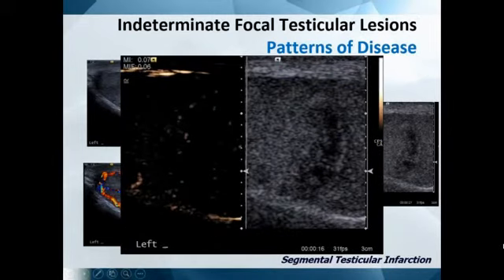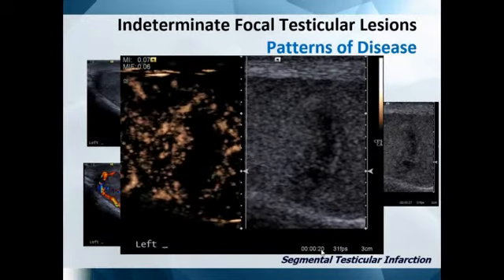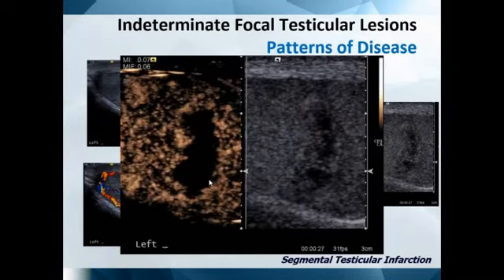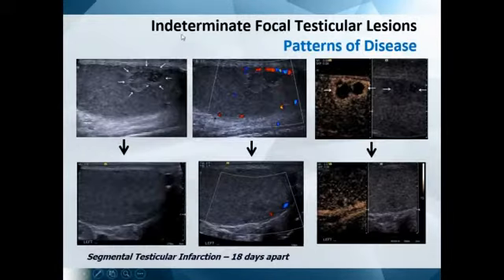And look at the dynamic examination in this patient. This is after 19 seconds, 20 seconds after injection, and you can see how clear it is that this is a well-demarcated area of infarction. You have the diagnosis, you can confidently wait with that patient and wait for that to resolve. This is another patient with rounded areas of infarction.